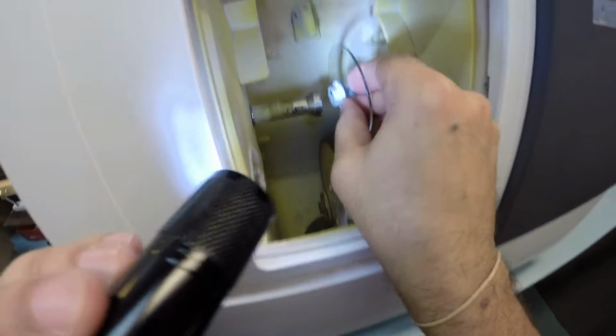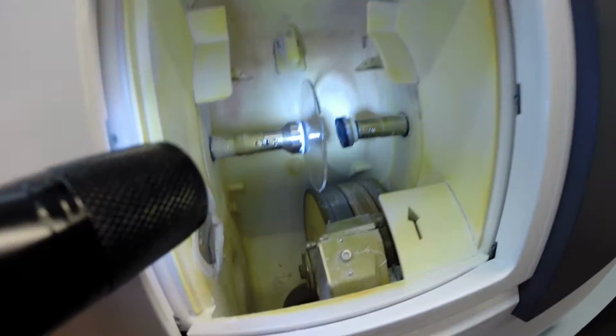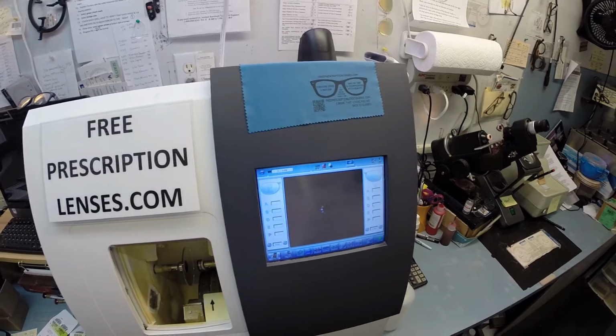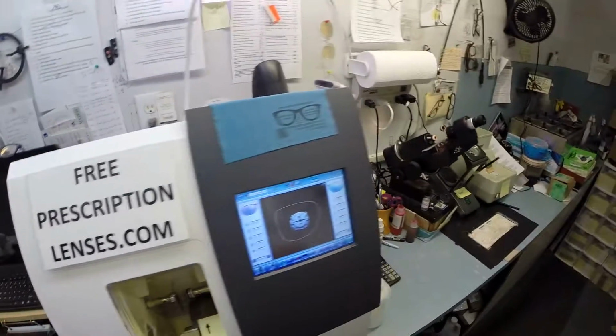Now the magnet that you see here is going to do its job a second time. It's going to hold it in place into the chuck, or as I like to call it, the Charles, because I'm formal and I don't know this machine well enough to call it Chuck. But I'm going to wake up the computer. That is the shape of the lens we will be cutting. Again, as you can see, it'll fit in there perfectly.